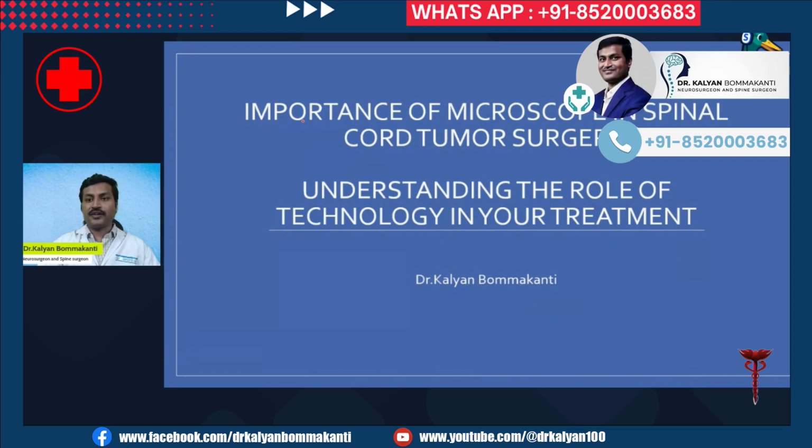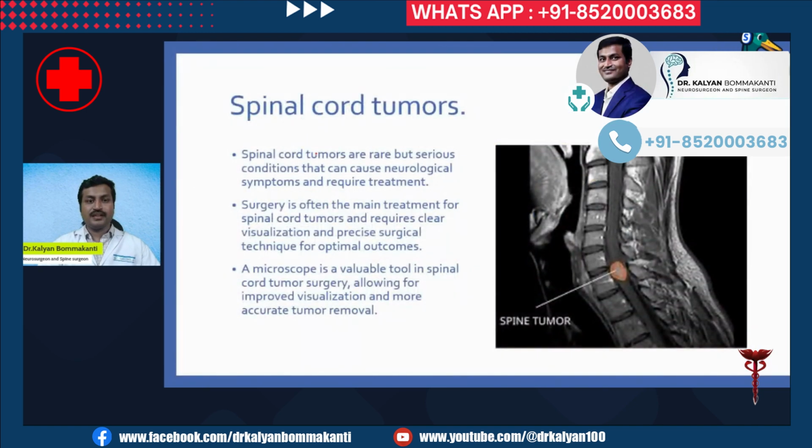So, the importance of the microscope in spinal cord tumor surgery. This presentation is part of the series on understanding the role of technology in your treatment. Spinal cord tumors are a rare but serious condition that can cause neurological symptoms and require treatment. Surgery is often the main treatment, and it requires clear visualization and precise surgical technique for optimal outcomes. A microscope is a valuable tool in spinal cord tumor surgery, allowing for improved visualization and more accurate tumor removal.